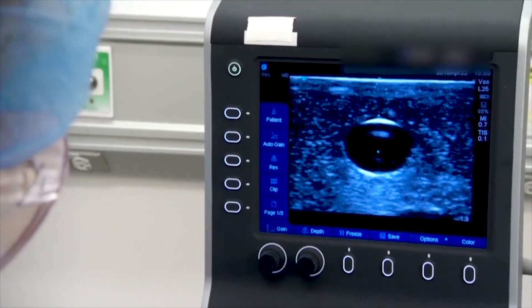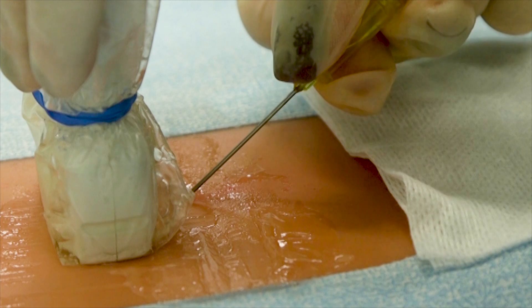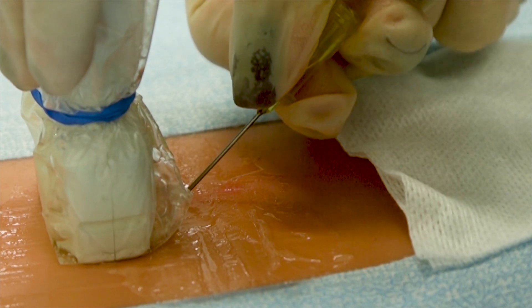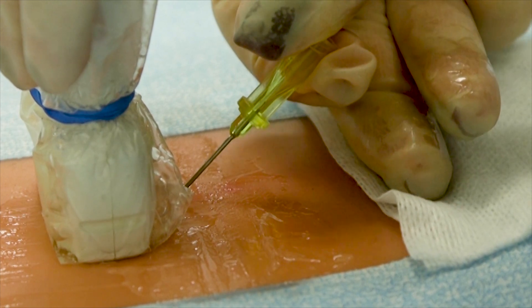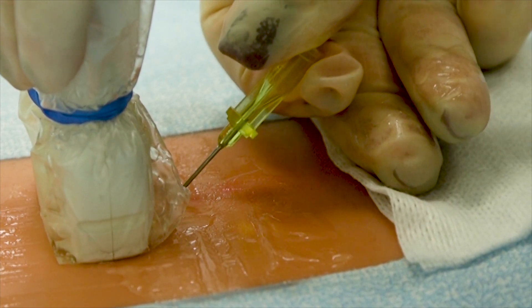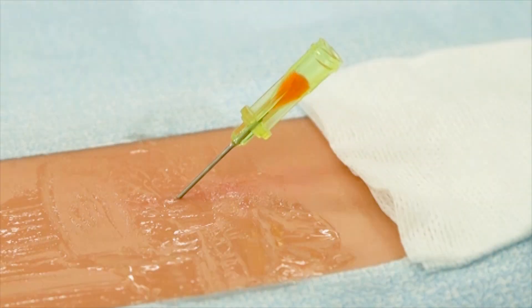Using the ultrasound, identify the artery. Puncture the artery with the introducer needle using a continuous, controlled, slow, forward motion. Once blood flow is visualized, stop. Blood flashback indicates a successful entry into the artery. Avoid transfixing both walls of the artery.